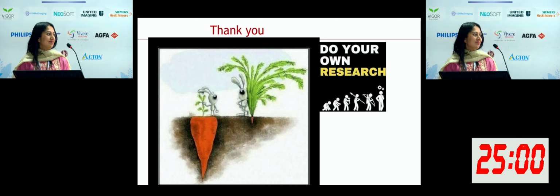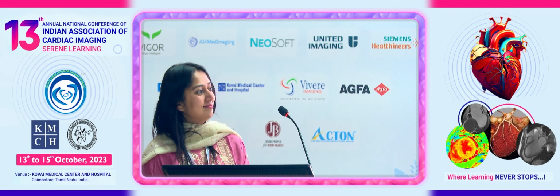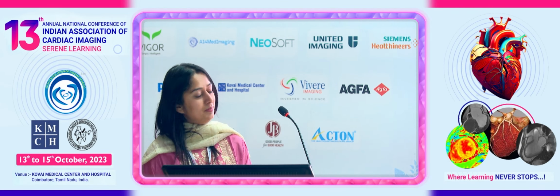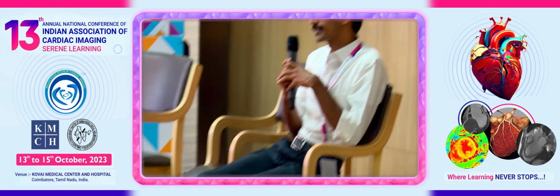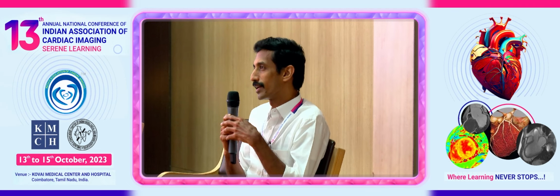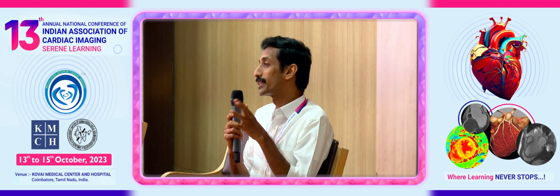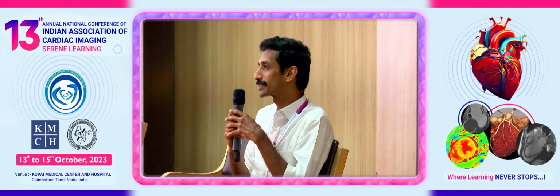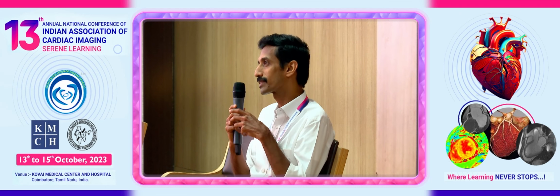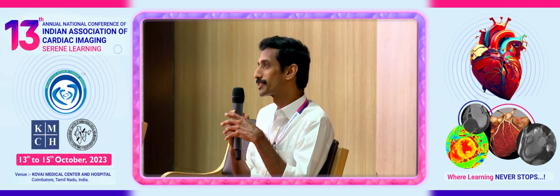That's an excellent presentation. It's good to know that there are options for non-invasive FFR testing, and it has a lot of room for further development. From the surgical aspect, I think maybe in multivessel disease, when the non-LAD territory is not very significant, and if the FFR is low, then we can go for a minimally invasive access to revascularize the LAD alone. So I think there is a subset of patients which might benefit.